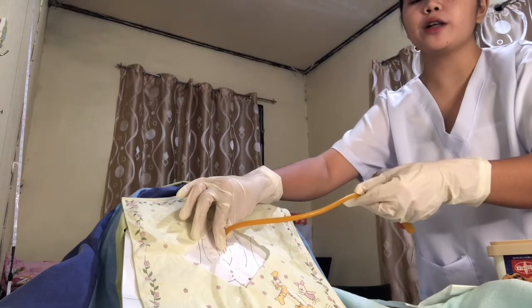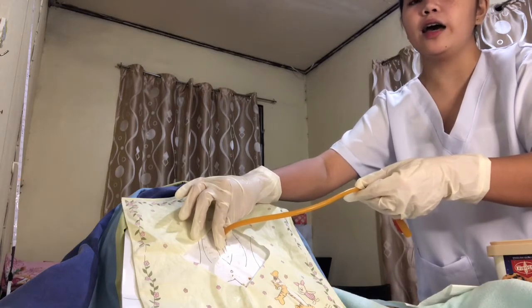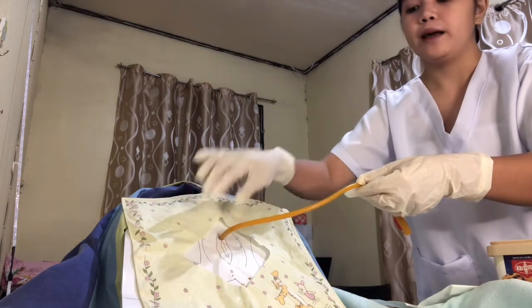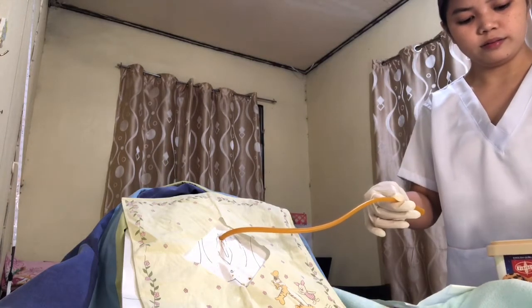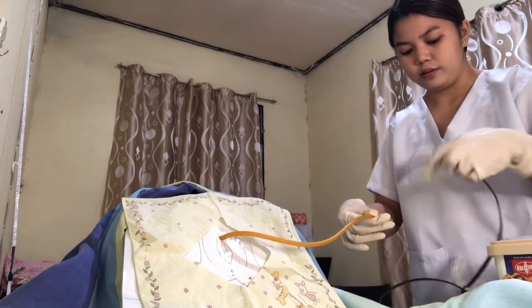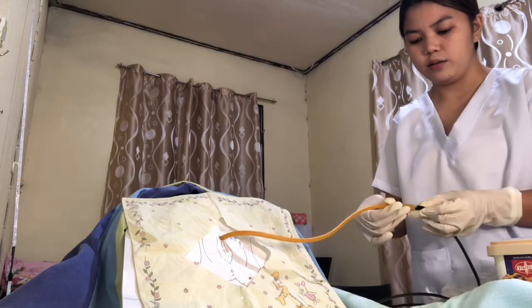So after that, we will connect the catheter to the urine bag and be sure the bag is closed and keep the connection sterile, so that the urine will not leak from the bag, maintaining its sterility. So we'll get the bag. This is an improvised catheter bag because we don't have any here. So this is an improvised urine bag.